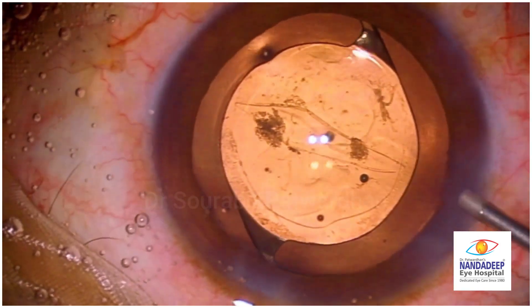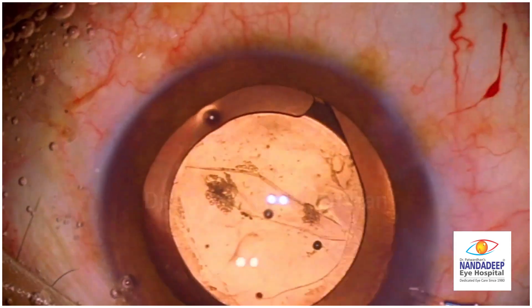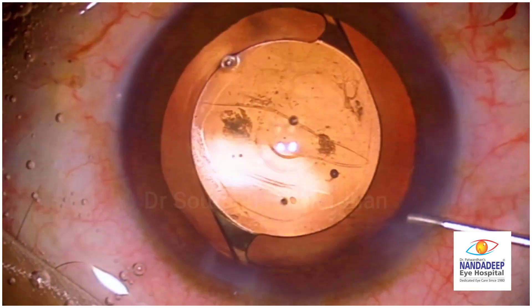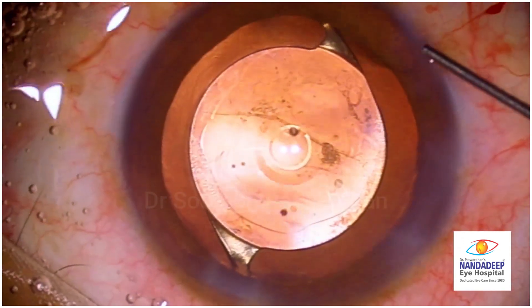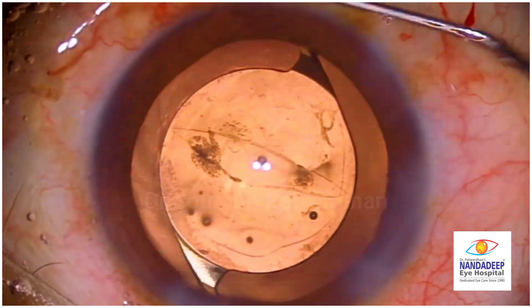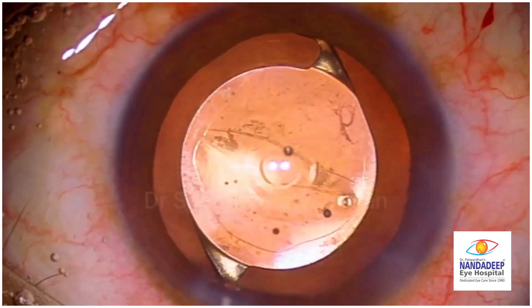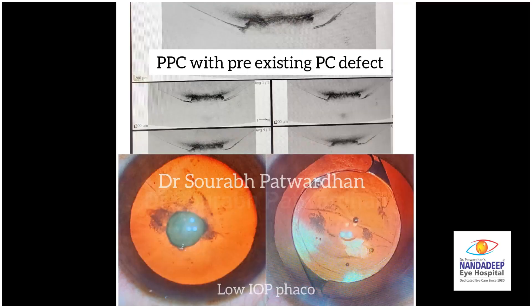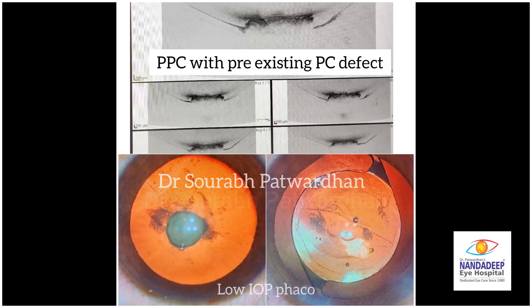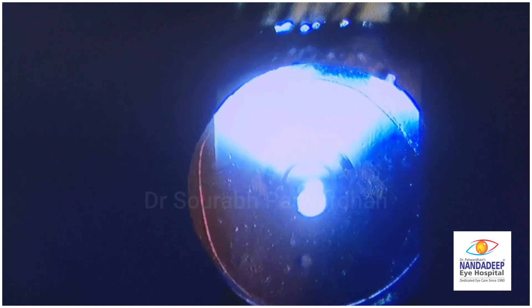So this is what I do generally — I just wash off the VISCO viscoelastic from the anterior chamber as far as possible. It takes 2–3 minutes to wash off most of the viscoelastic. If a little bit remains I will control the IOP — no problem. But it avoids the extension of the PC tear, and that's the nice outcome. The patient is extremely happy. Thank you.